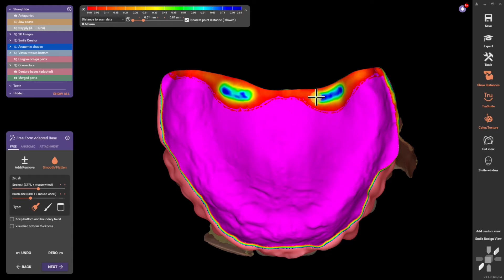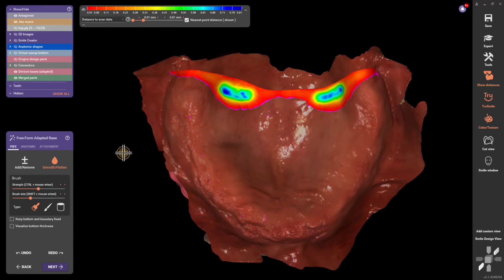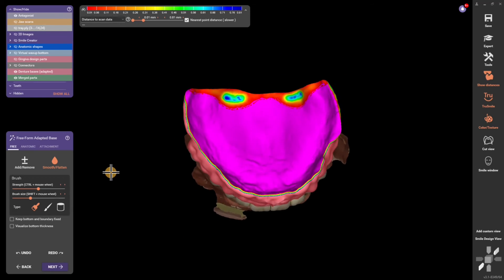800 microns of pressure right at the depth of the palatal aponeurosis, and then we're going to smooth that up. While we're at it, let's go ahead and add the patient's name.